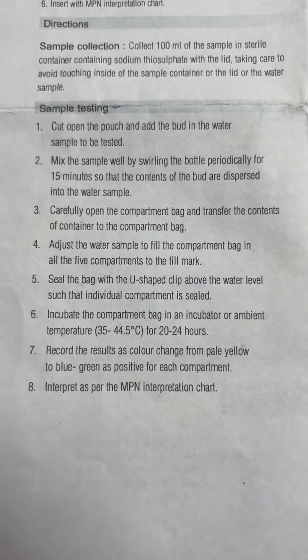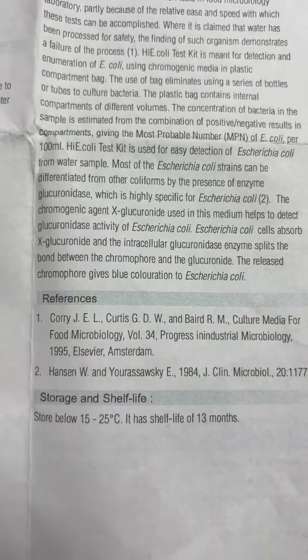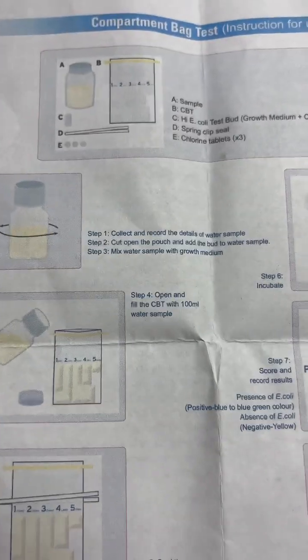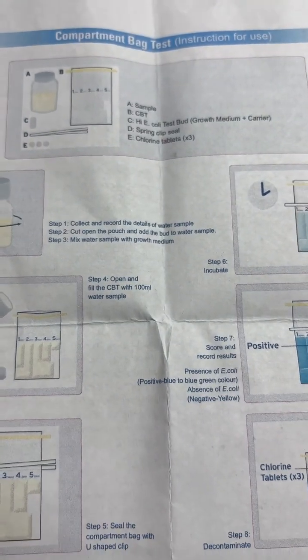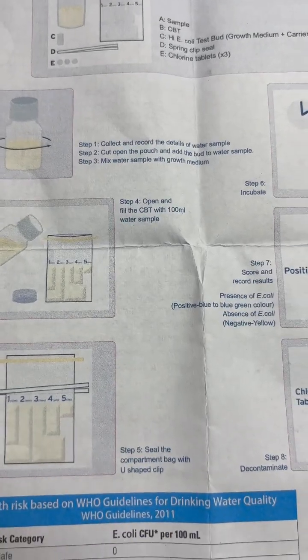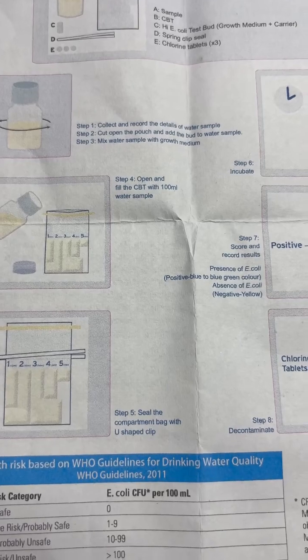Sample testing involves seven steps. The first step is to collect and record the details of the water sample. The second step is to cut open the pouch and add the powder to the water sample.